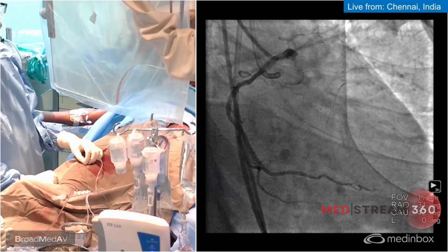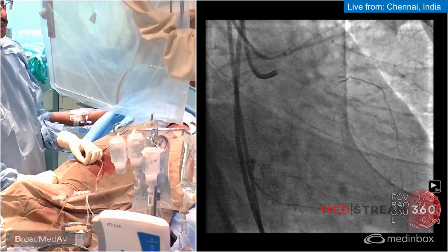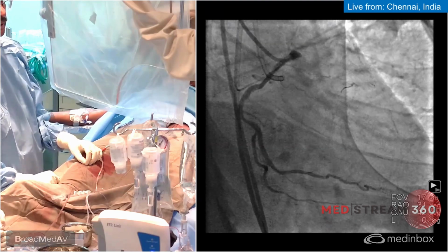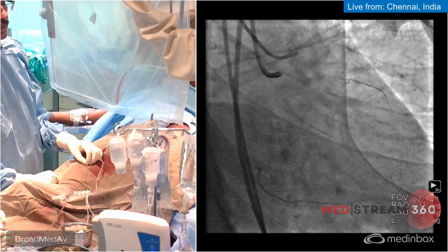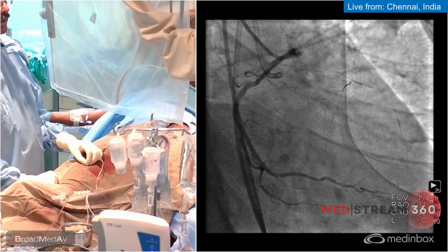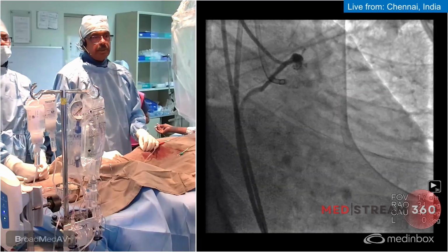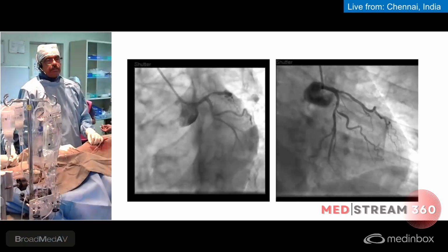The history doesn't seem to be too long, so I wouldn't call this a chronic total occlusion. It seems to be 100% occlusion of acute form. So what our plan was to try to cross that LAD through antegrade and if possible wire down the LAD and then see what we see on the IVUS, if the disease is in the LAD or the circ. So we'll have to decide after as how we fix that. There are two options. There's not a big OM. One is we could just balloon it and get out and then fix the left main to LAD stent.